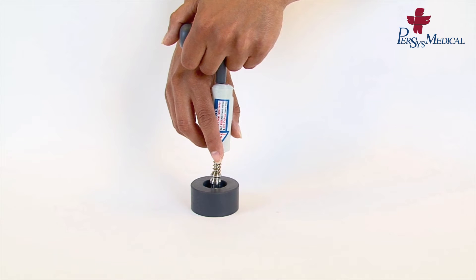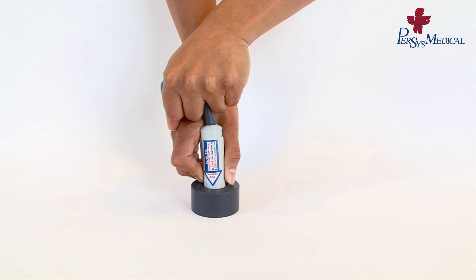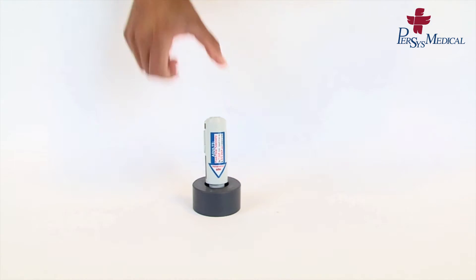Hold the top barrel in one hand while you insert the special T tool into the hole on top. Then push down on the piston and plastic barrel as far as possible. Then pull up the outer plastic part of the barrel until it clicks into place.